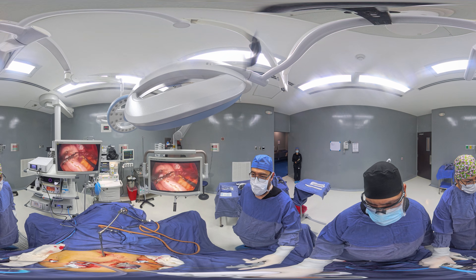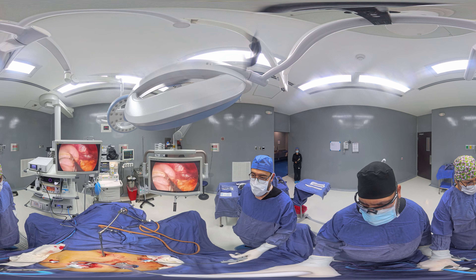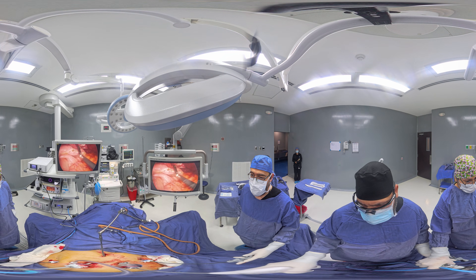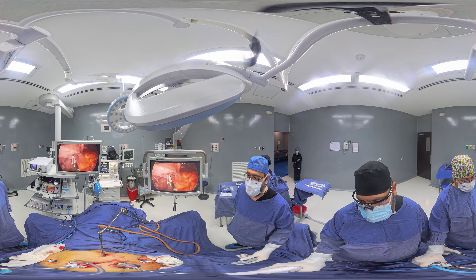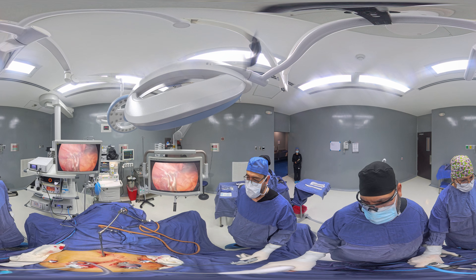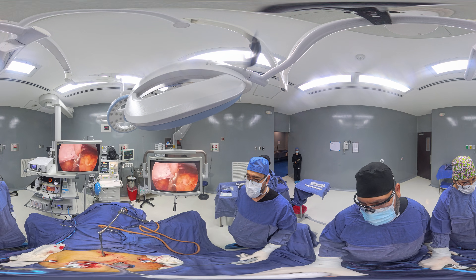This is where the stomach is closest to its next-door neighbor organ, the spleen. This particular patient, she's a female patient, has some adhesions on the posterior wall of the stomach toward the pancreas. Quite common to see.